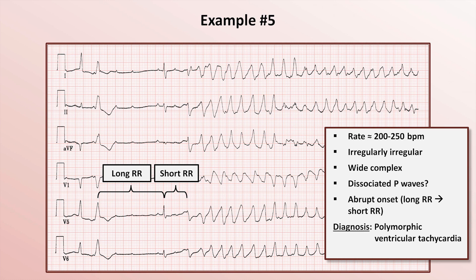The two RR intervals immediately preceding the rhythm onset consist of one unusually long RR interval and one unusually short one. This specific pattern means that this polymorphic VT is the torsade des pointes subtype, which is almost universally associated with a prolonged QT interval — though in this particular example, it's impossible to say what that QT interval actually is.